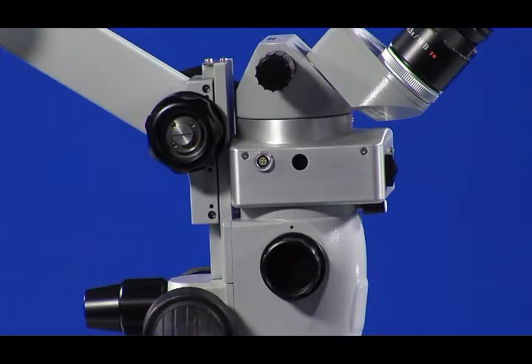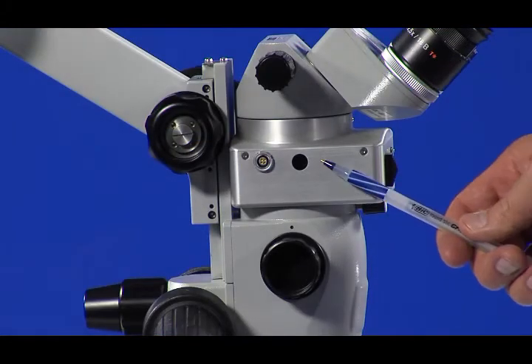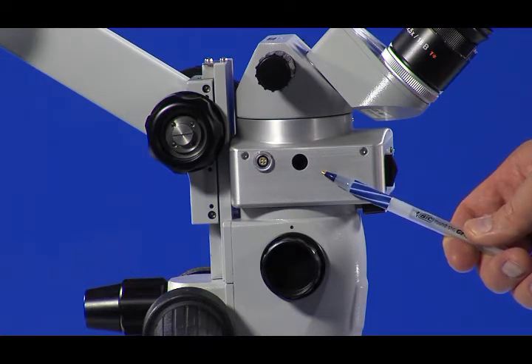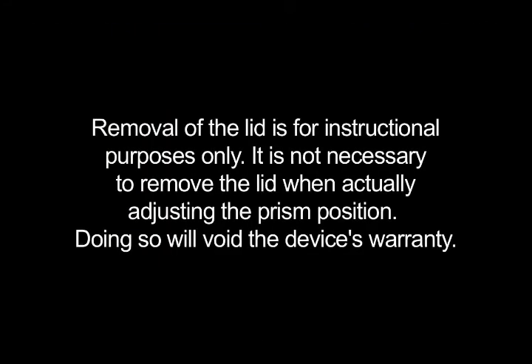The screwdriver is used on the left side of the Rolls Infinity to adjust the prism's position when the locking bolts are loosened. It accesses the prism through the access hole on the left side of the housing. To better understand how the prism adjustment works, it is helpful to see the internal mechanics of the Rolls Infinity reinverter. Removal of the lid is for instructional purposes only — it is not necessary to remove the lid when actually adjusting the prism position, and doing so will void the device's warranty.